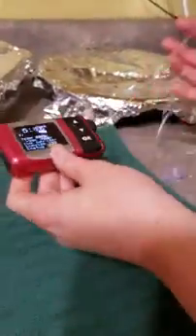Okay? So this is our diabetic cabinet. We don't have a lot of space, but I have a cabinet, and so I need her insulin. We use Humalog. This is just like the thing we're going to use for the Omnipod.